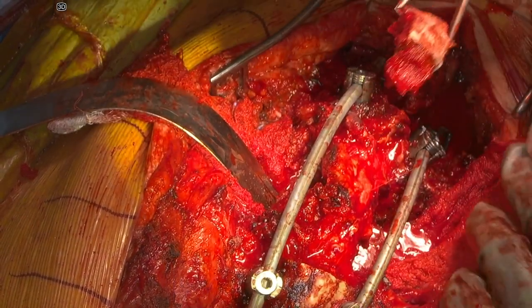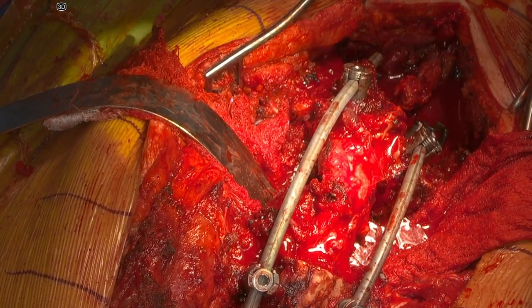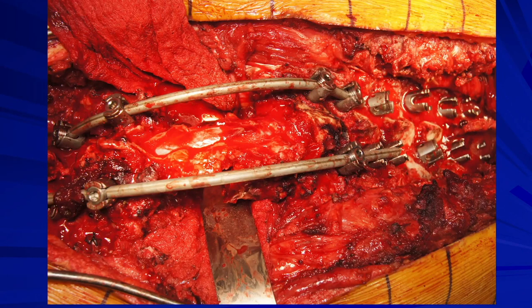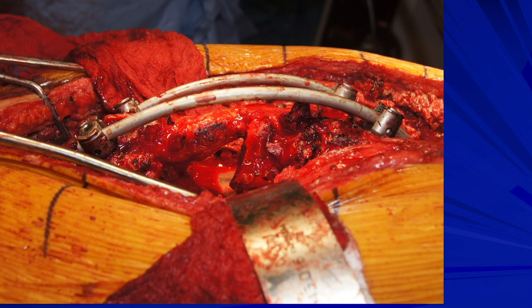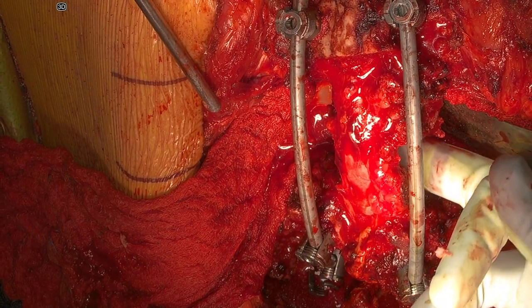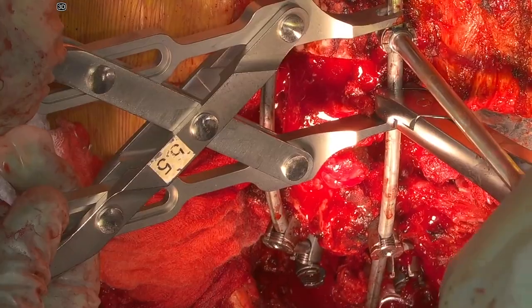Now the spinal cord is free. You can see the pulsations. Posteriorly it is thoroughly decompressed and anteriorly it is thoroughly decompressed as well, as shown in this picture. The angulation of the vertebral bodies is quite apparent. Any remaining soft tissue or bony elements are checked and removed.